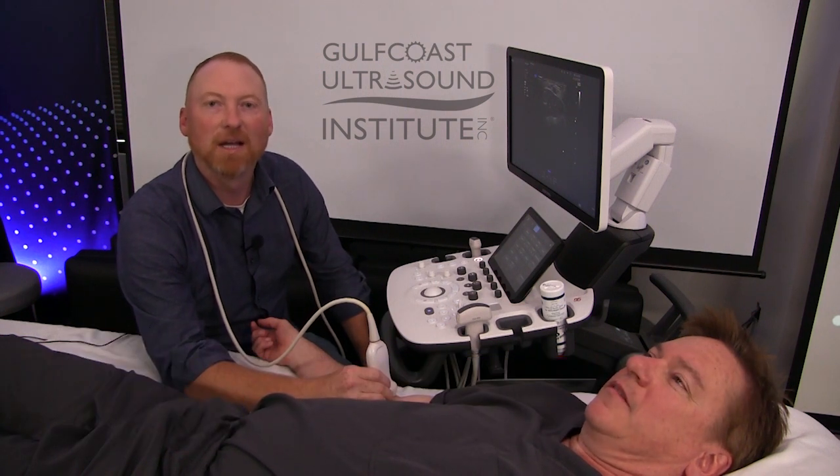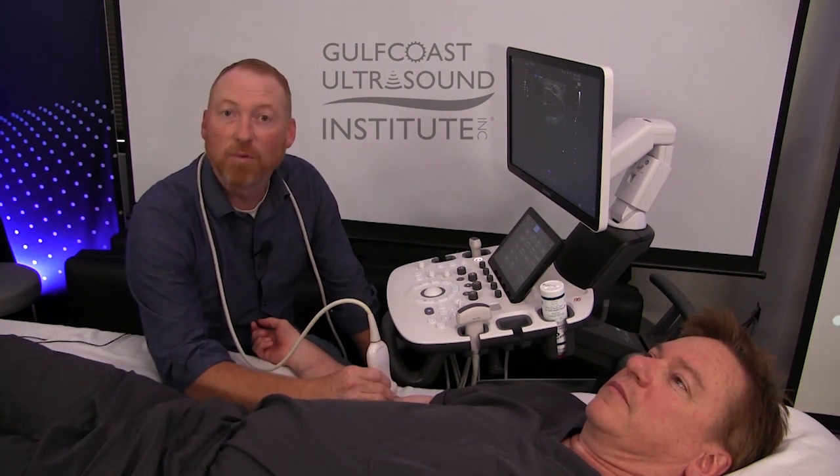Hi, I'm Dr. Blake Randalls with Gulf Coast Ultrasound Institute and this is my hot tip of the day. We're going to be talking about identifying the biceps brachii tendon at the forearm using the brachial artery as a window.